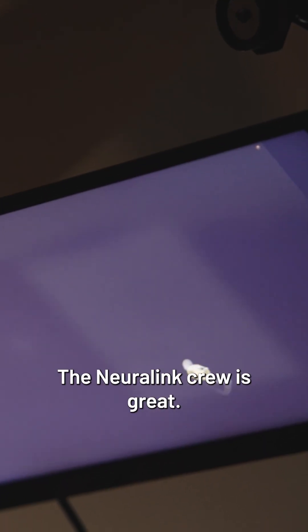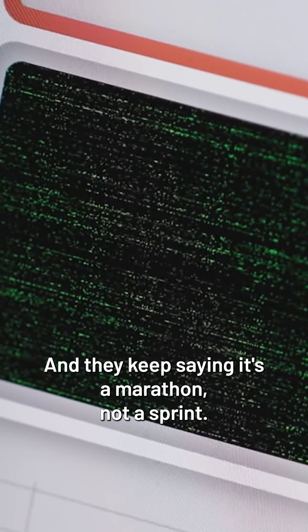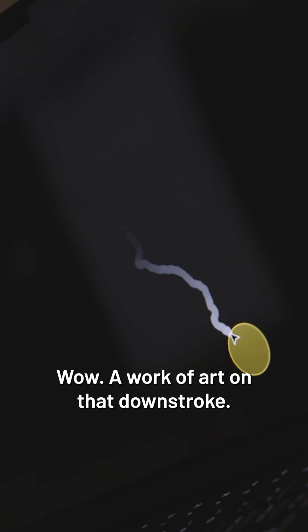The Neuralink crew is great — in and out. Oh, you got it! We're just trying to learn what we need to learn, and they keep saying it's a marathon, not a sprint. Wow. A work of art on that downstroke.